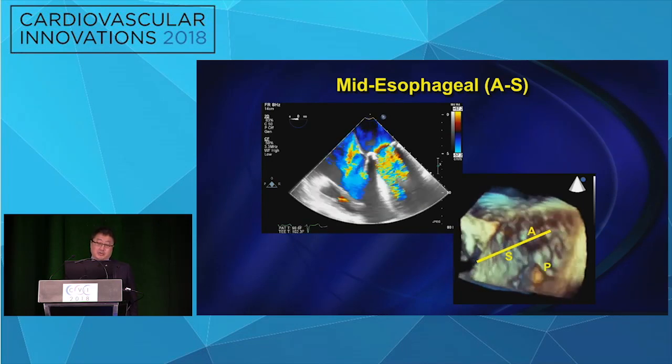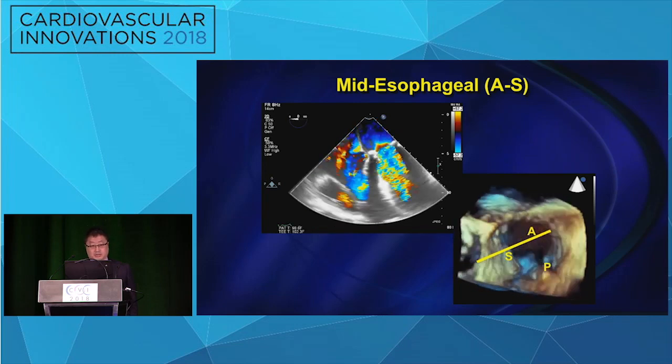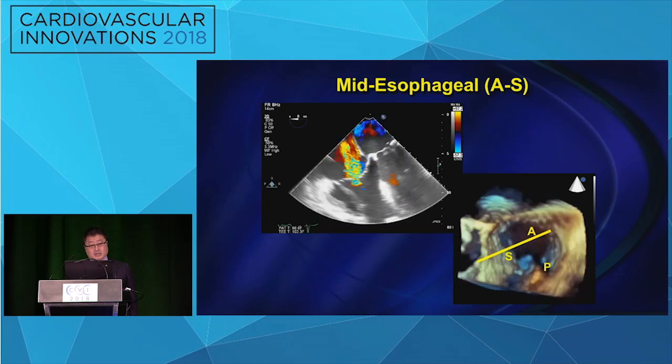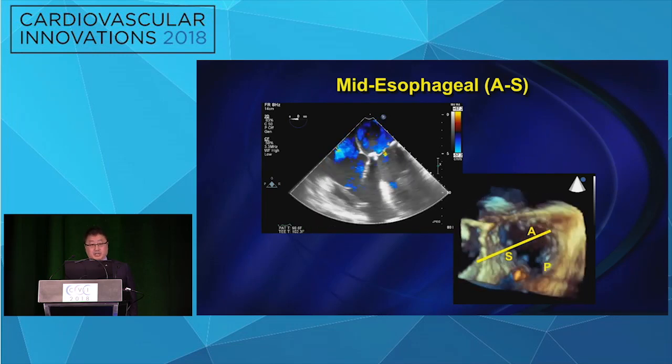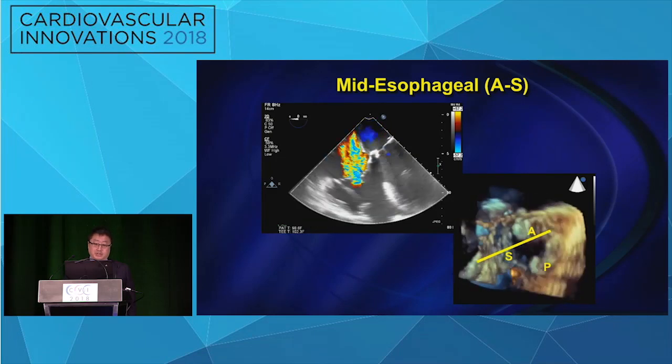Analogous to the apical four-chamber view, if you see the LV opened up, you see the septum, so you know that you see the septal leaflet. The challenge is usually, are you looking at the anterior or posterior leaflet otherwise? In this view, both images were in the same patient. You can see this patient has a pacemaker lead deep between the septal and posterior leaflets. In the four-chamber view, we see the septal and anterior leaflets.